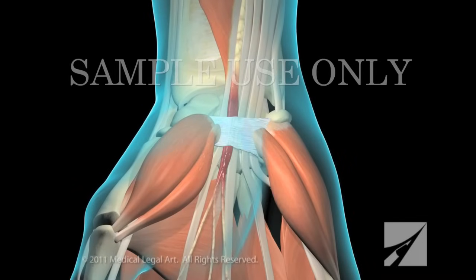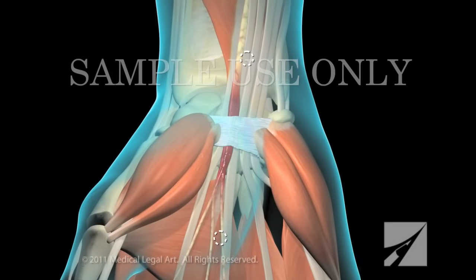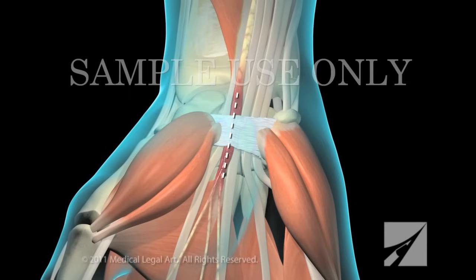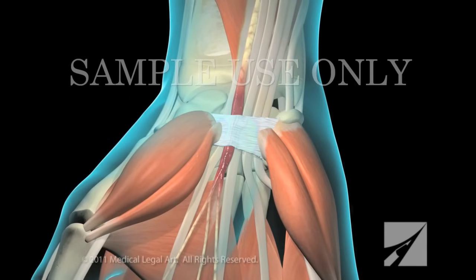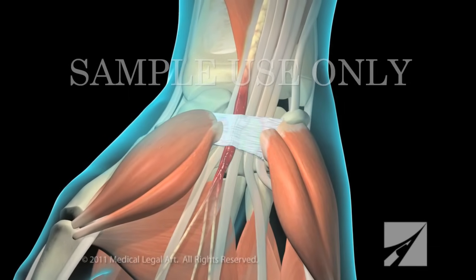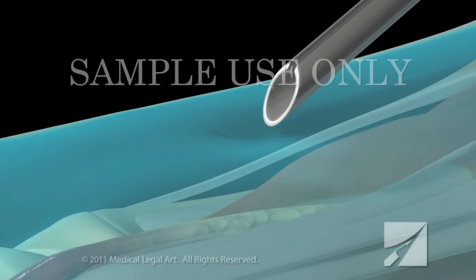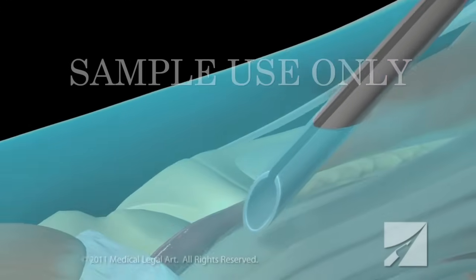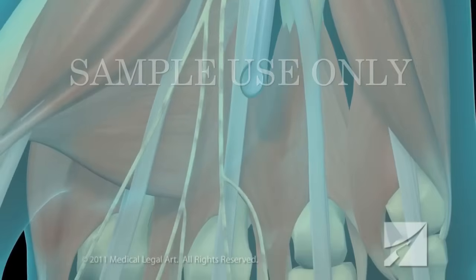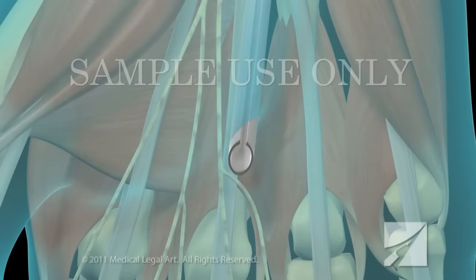A minimally invasive technique requires only two tiny keyhole incisions or puncture wounds rather than a single relatively large incision. It is designed to produce a shorter and less painful recovery period. The procedure begins when your surgeon uses sharp instruments called trocars to make two small openings or ports in your wrist and the palm of your hand.